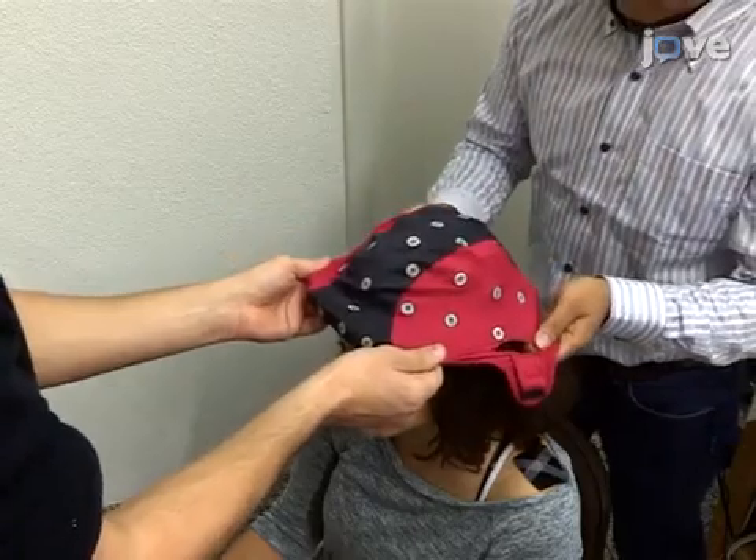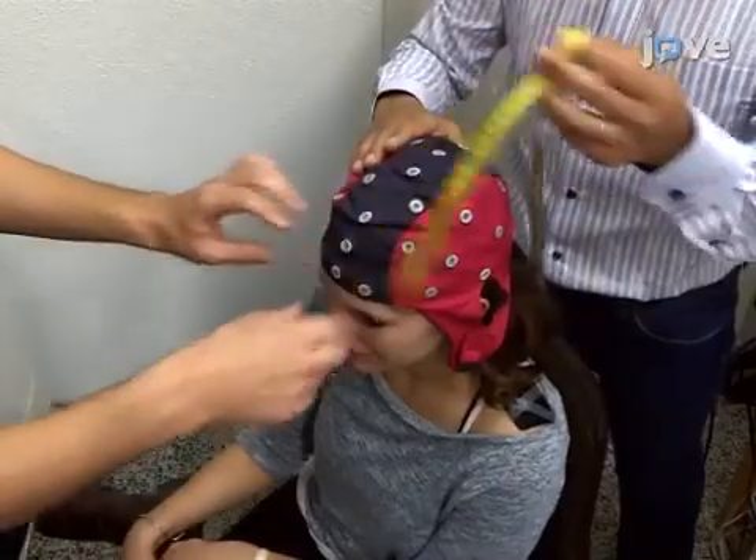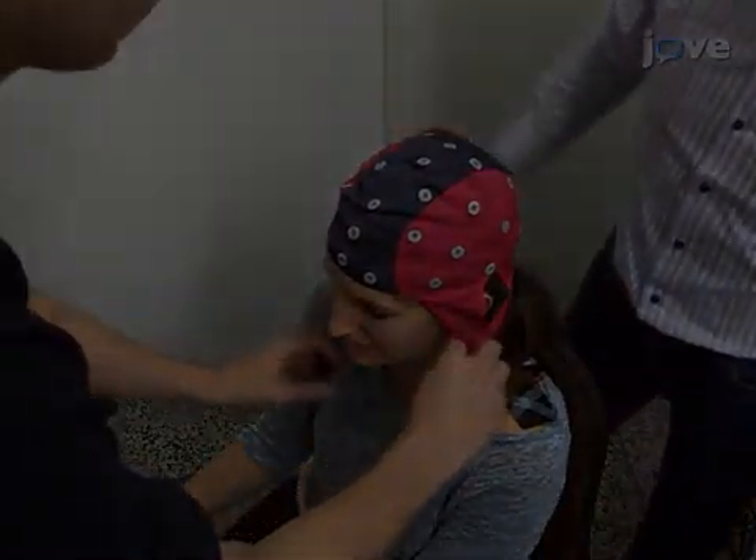Next, put the EEG cap on the participant. Adjust the position of the cap according to the International 10-20 system.